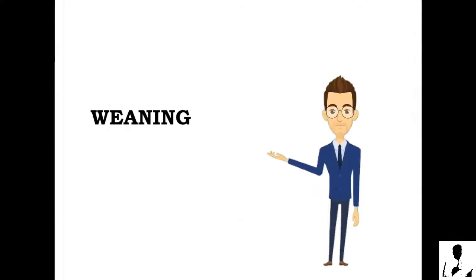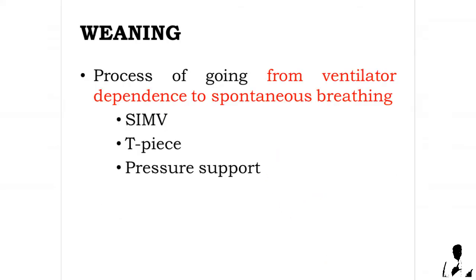Weaning. A process of going from ventilator dependence to spontaneous breathing. And the following are the things to consider during weaning. Synchronized intermittent mandatory ventilation, SIMV, T-piece, and pressure support.